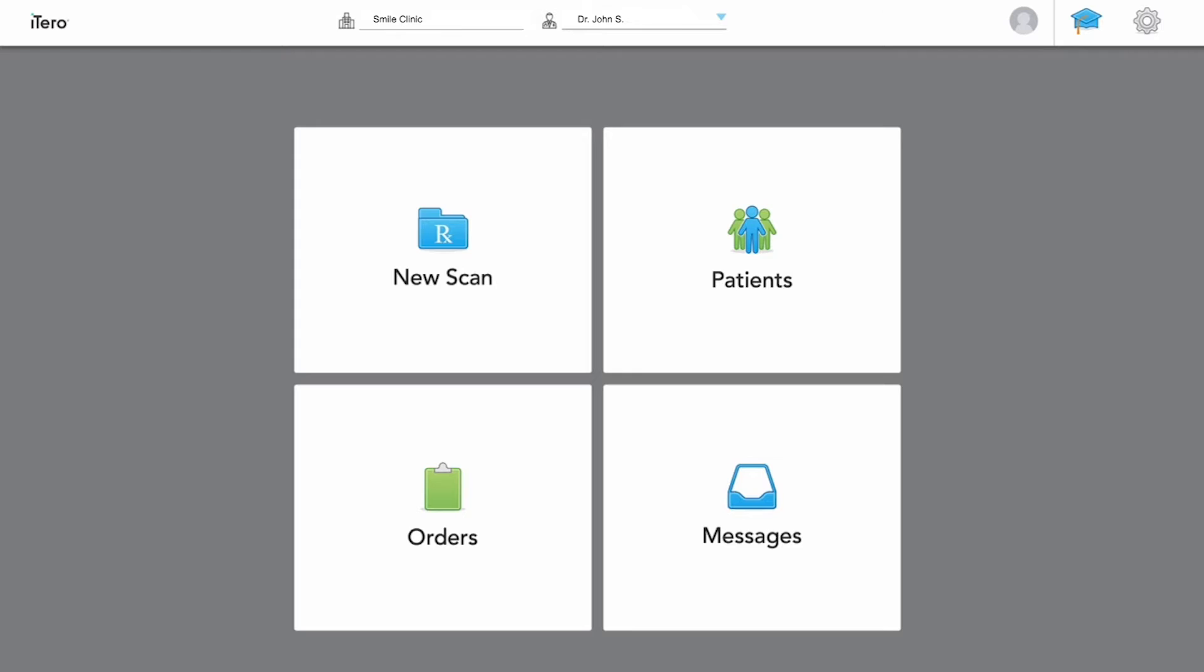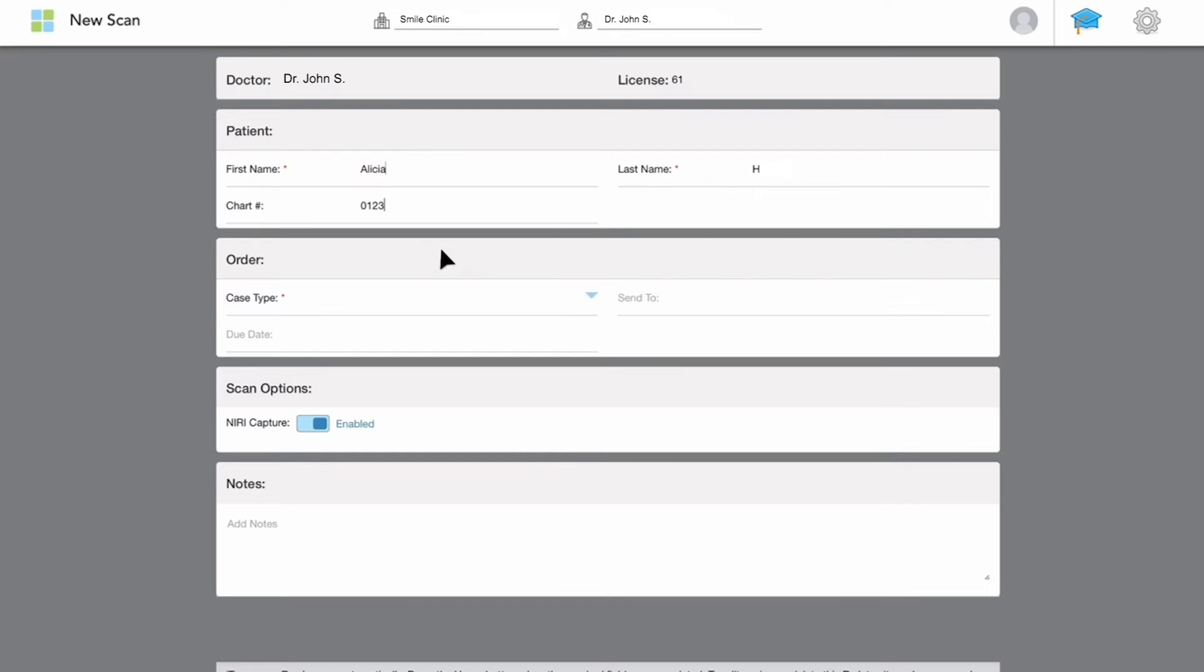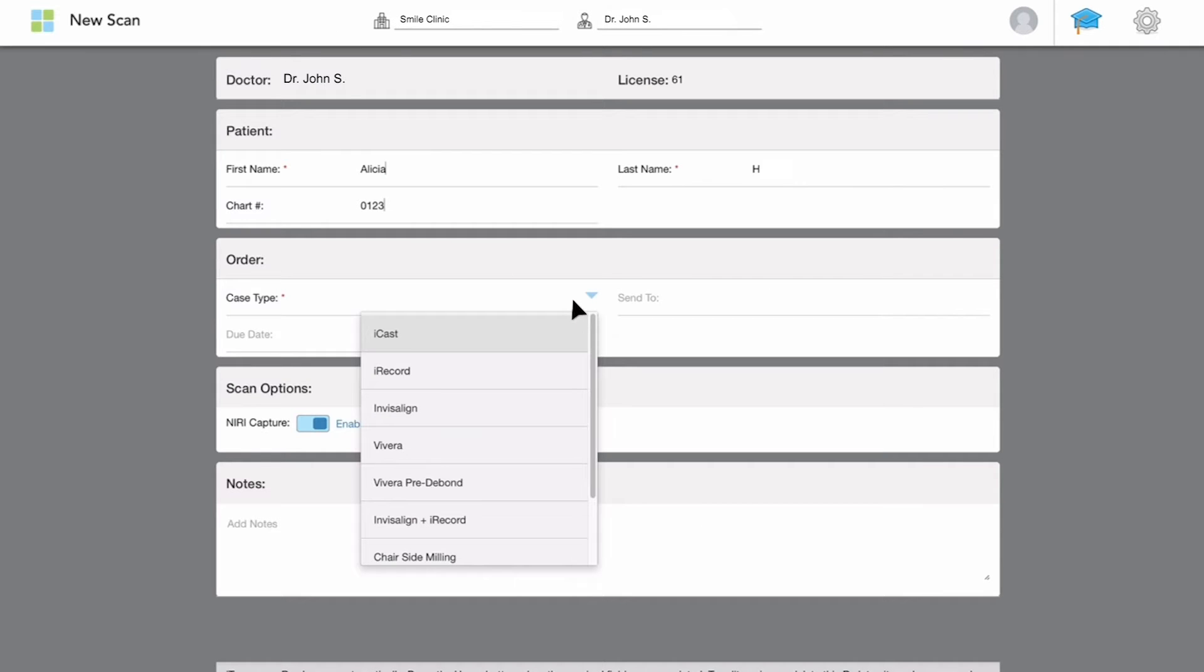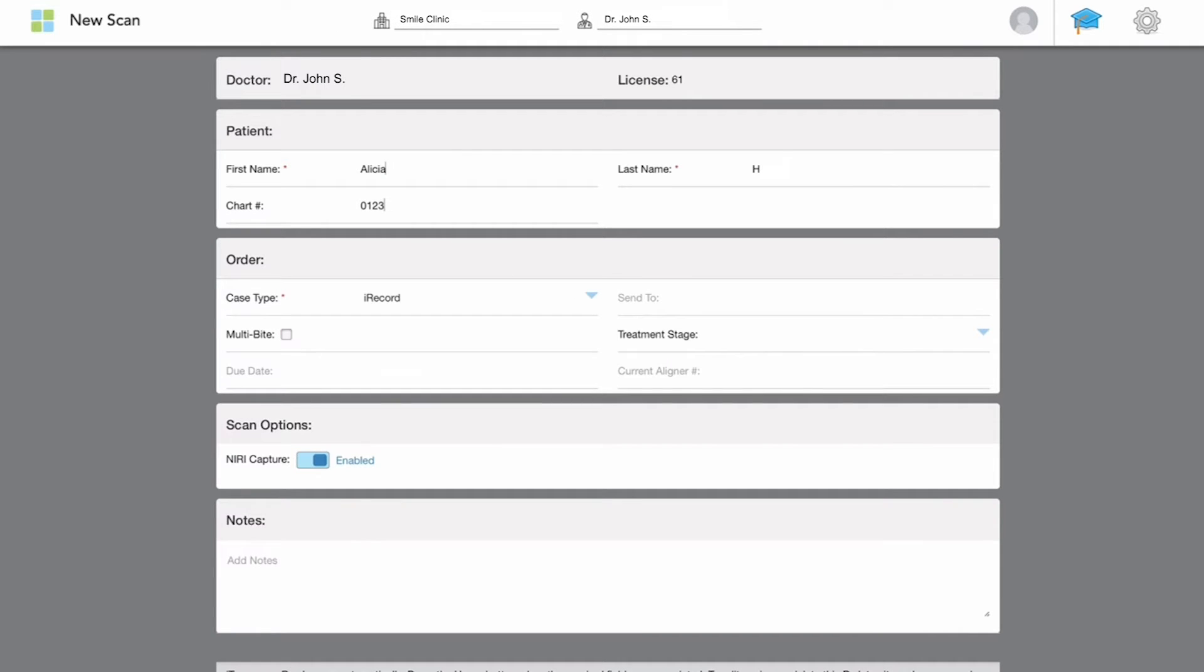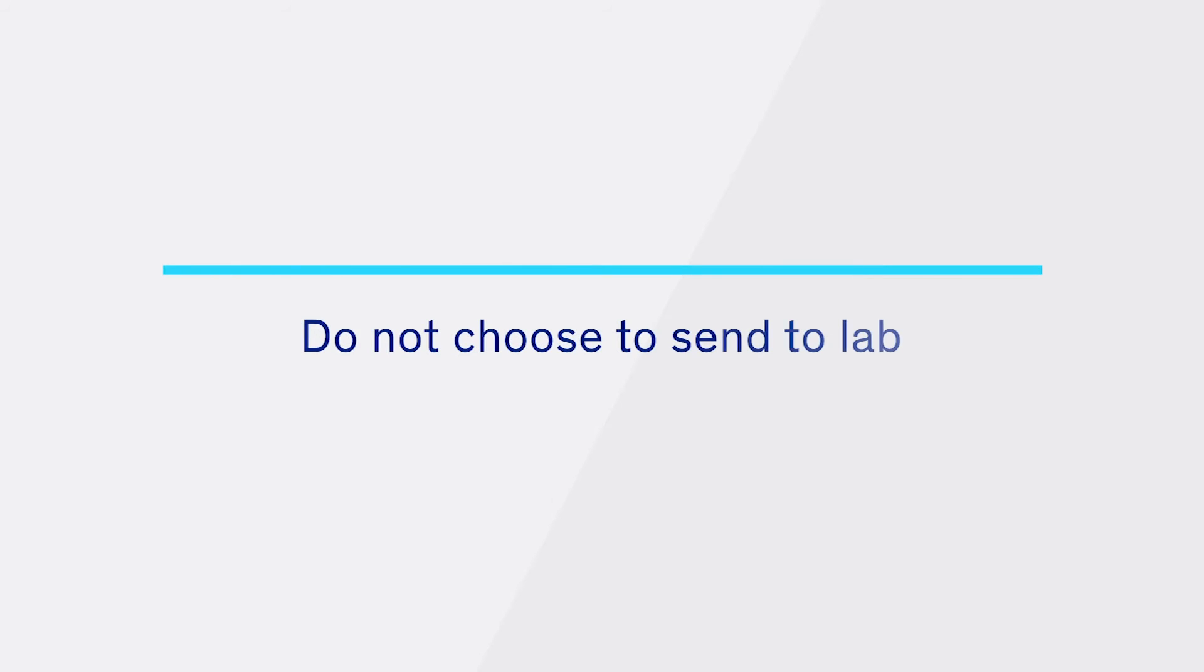Select New Scan on your iTero homepage screen. Type the patient's name and select the case type as iRecord. Once the scan has been completed, do not choose to send it to the lab.